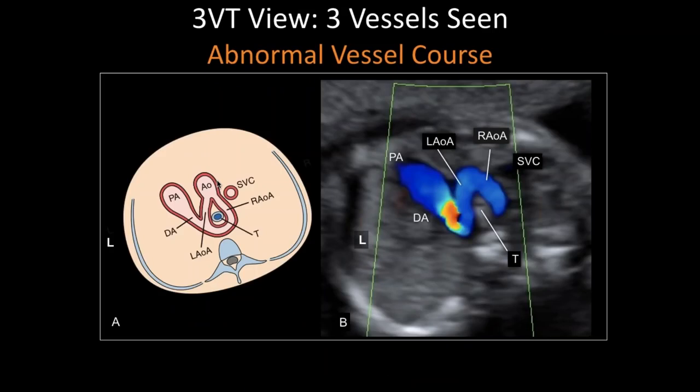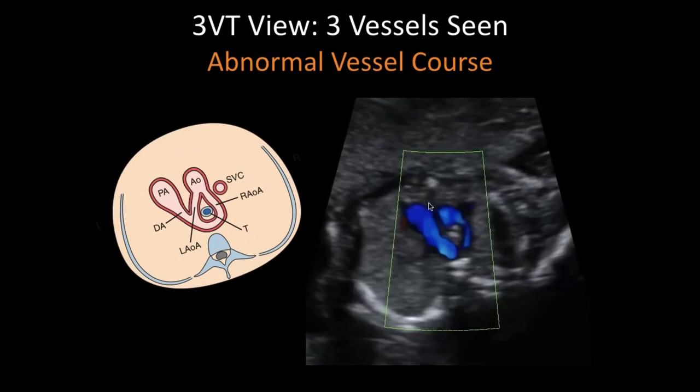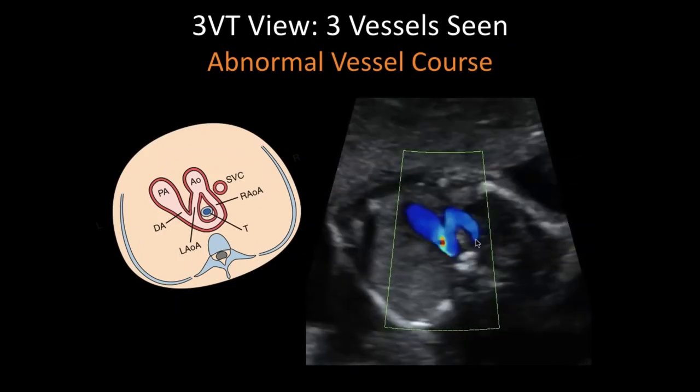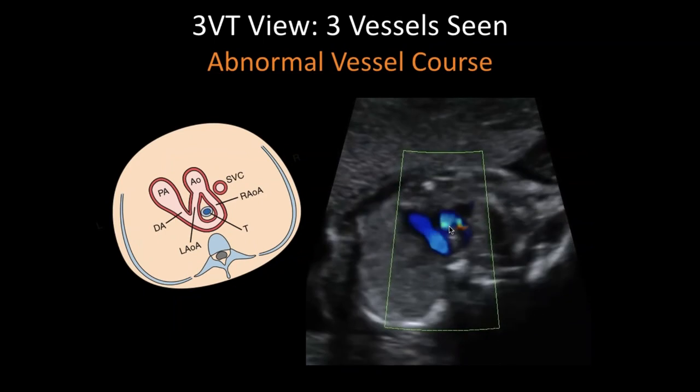Here's a double aortic arch. There's a left and right aortic arch around the trachea. And look at this clip right here. So here's the aorta coming out. There's a left ductus arteriosus clearly seen. But look how the aorta divides, and you can form the circle all the way around it.